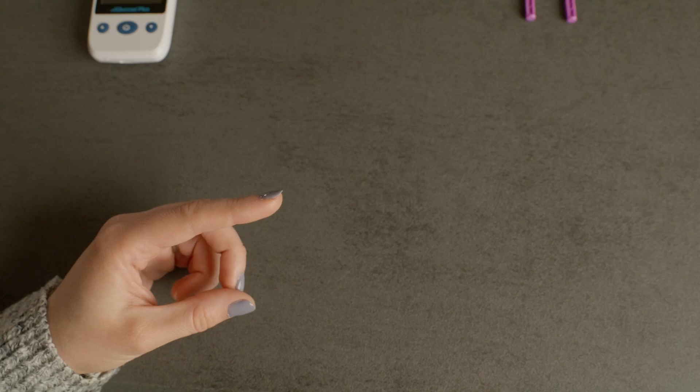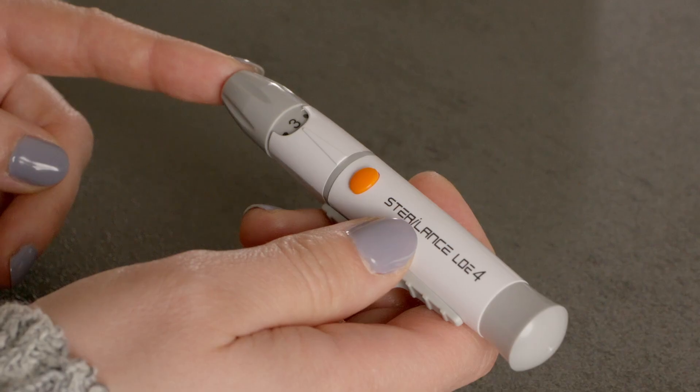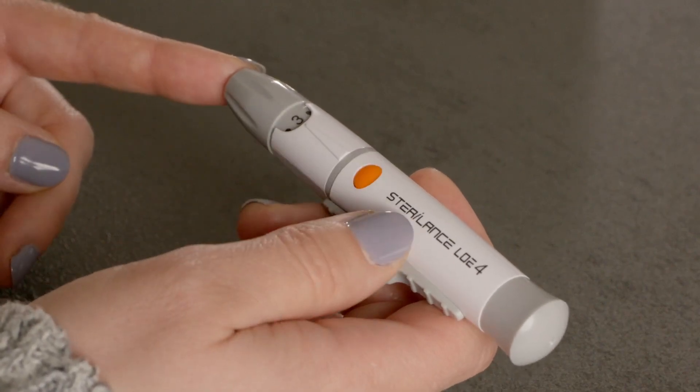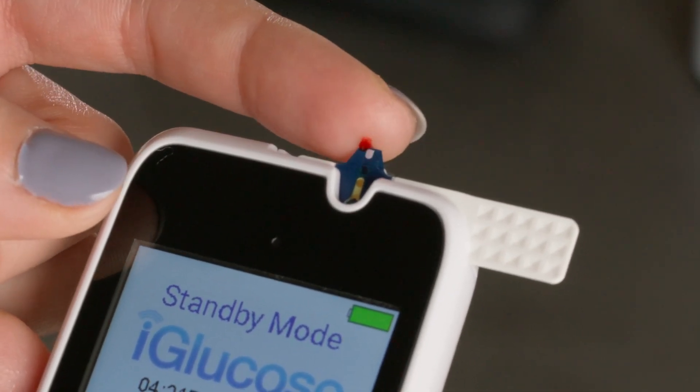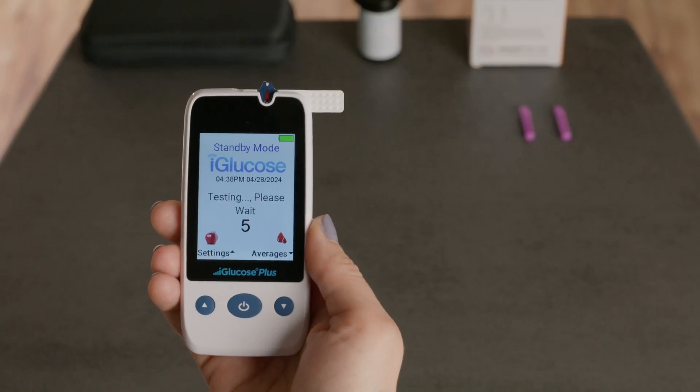Now, let's get a blood sample. Take your lancing device and place it on your finger. Press the release button to get a drop of blood. Gently touch the tip of the test strip to the blood drop. The strip will draw the blood in.